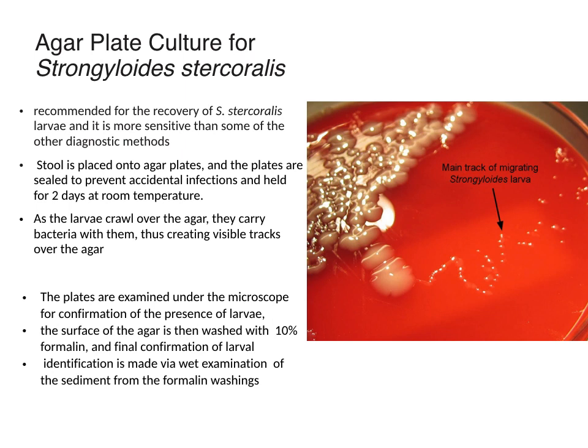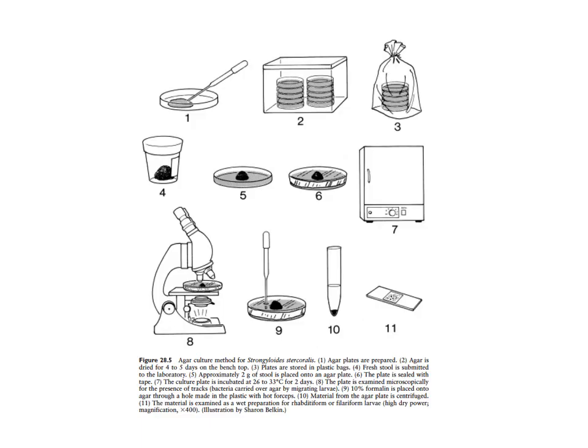Plates are then examined under the microscope or washed with 10% formalin for larval identification. So this is the technique once again.